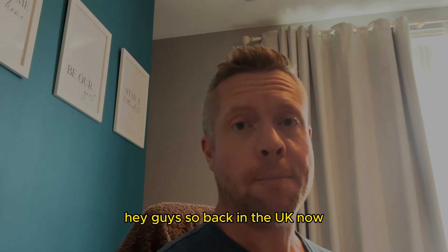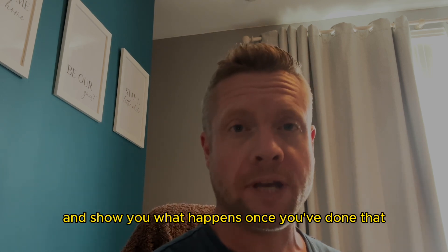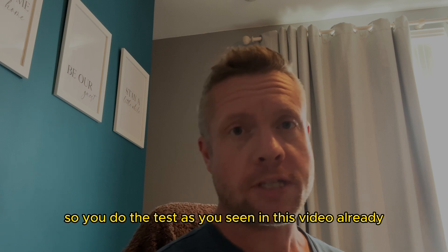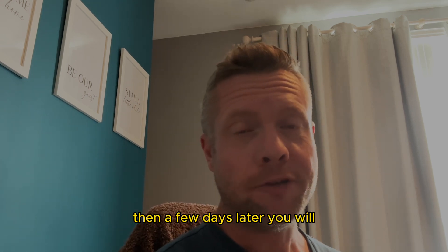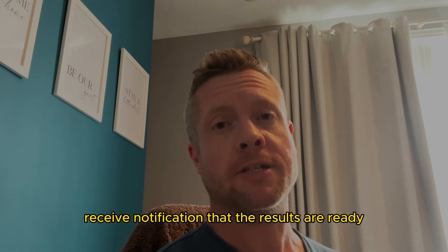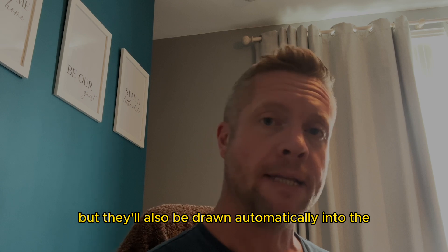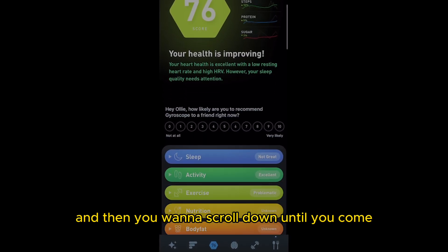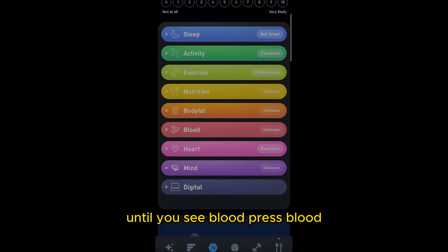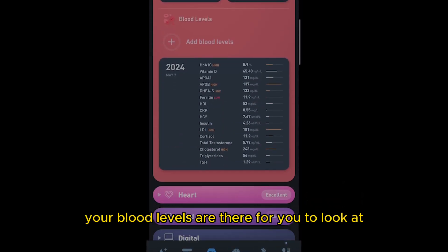Back in the UK now — I did the Gyroscope blood test as you saw and I just want to explain what happens once you've done that. You post off your sample to the lab and a few days later you receive a notification that the results are ready. They're uploaded to the website but also drawn automatically into the Gyroscope app. Go into your health tab, scroll down until you see 'blood,' press it to open the drop-down menu and see your blood levels.